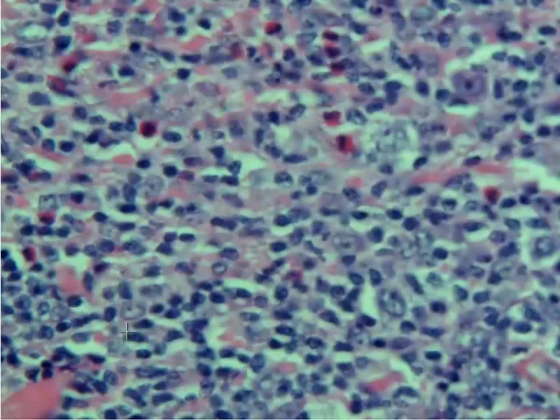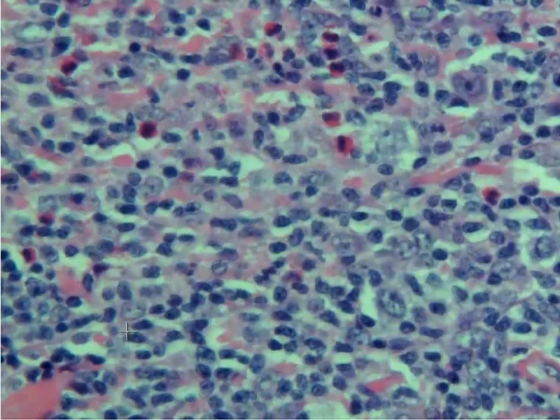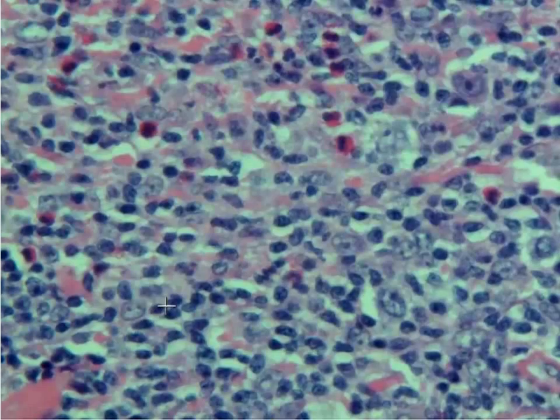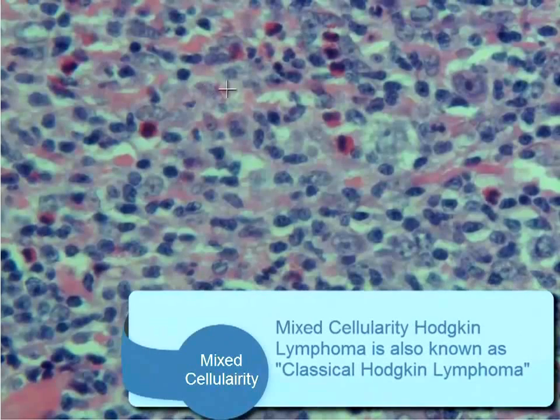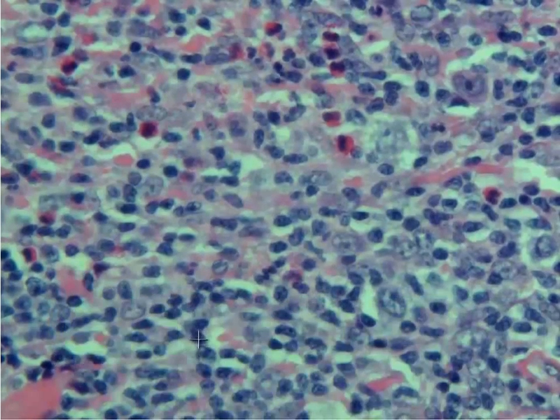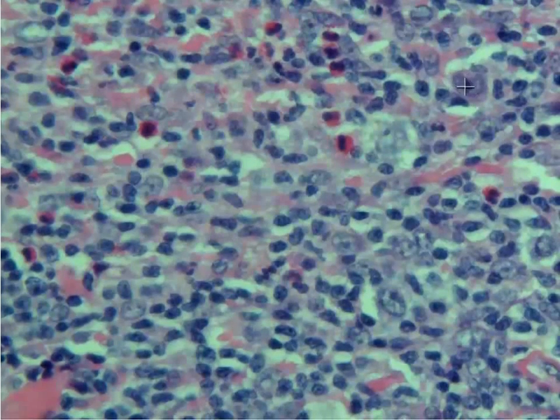If we go down to higher power and take a look at these cells, we'll try to find some Reed-Sternberg cells. This is an example of the classical type — the mixed cellularity Hodgkin lymphoma. You'll notice that we have several eosinophils — those bright pink cells — lots of lymphocytes, which are the little blue cells, and then occasional large cells with big prominent nucleoli. That's a Reed-Sternberg cell.